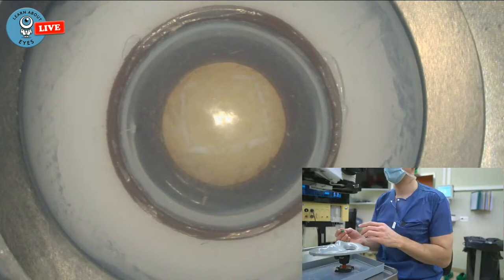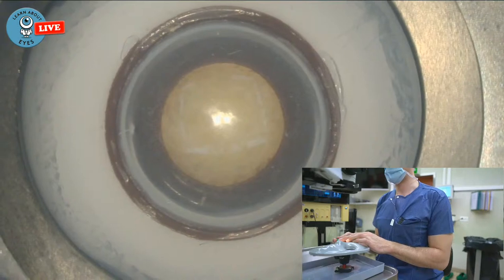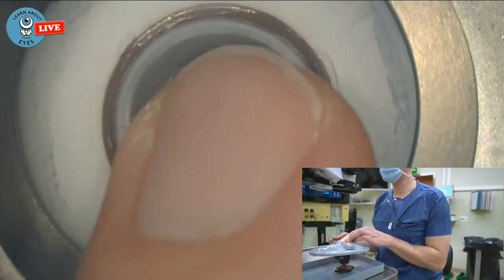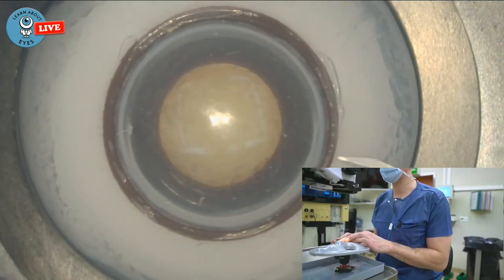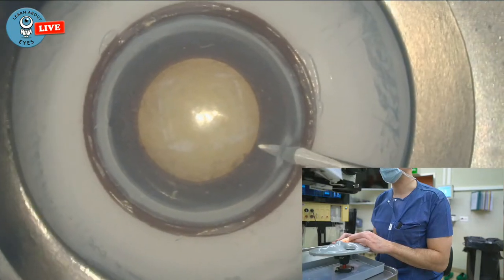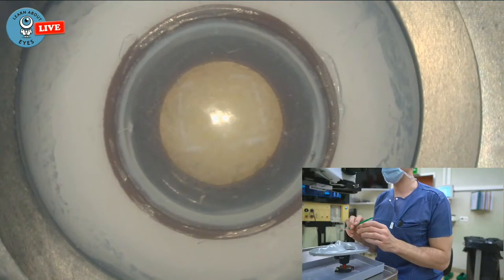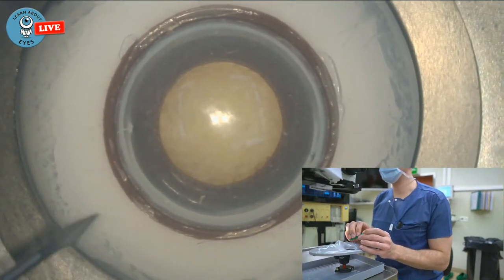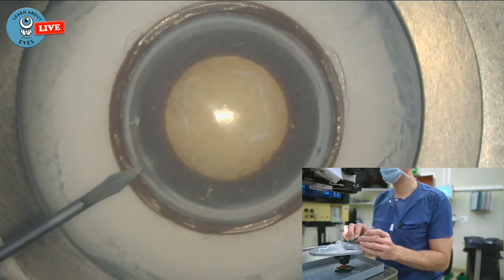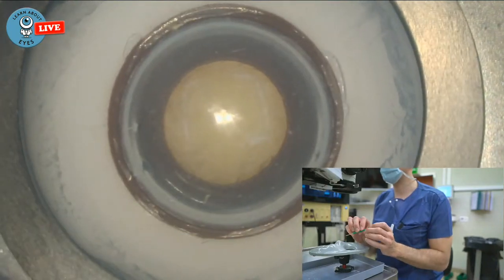All right. So let's go to the microscope. This is a 20 gauge paracentesis. Now this is of course filled with air, so it's going to be a bit weird, but well, doesn't matter that much. So I'm going to do the paracentesis here. Okay. And then what's also weird is that it's not bleeding, so it can be hard to find them again. Okay. And then one here. Try not to hit the capsule. Okay.